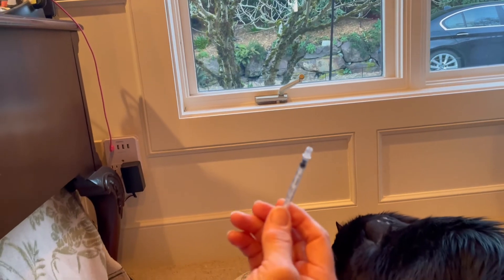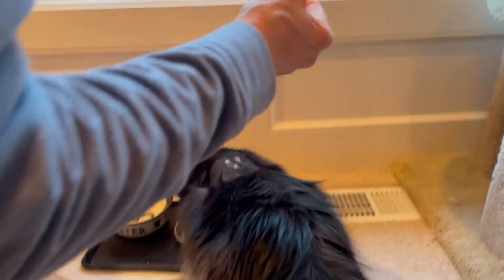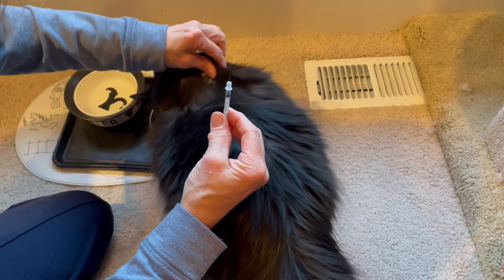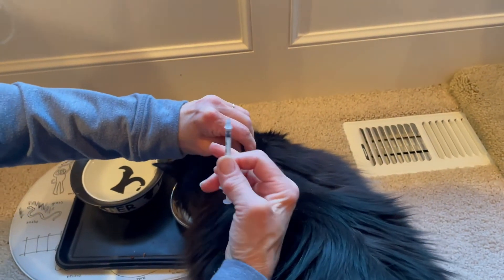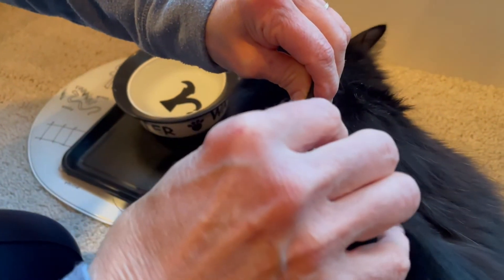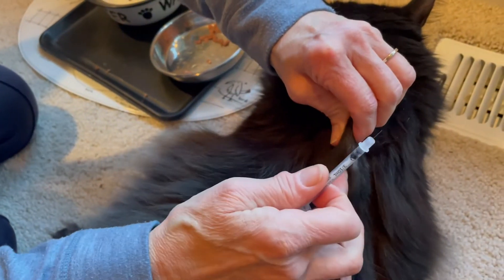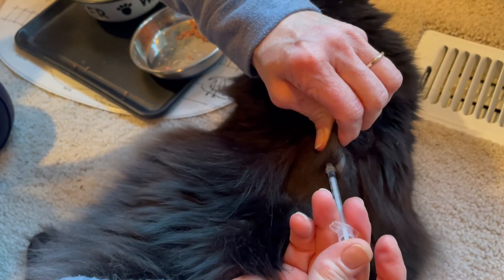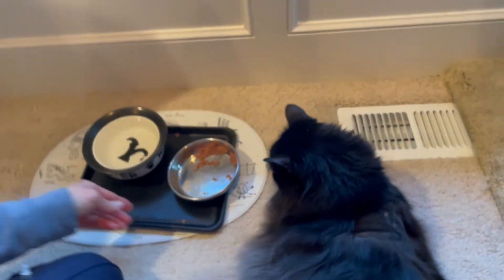It's a tiny little needle. Come over here, little Miss Tabitha. You grasp her skin — just want to pull up some skin. You can see this little pocket that it makes here. Right there, just go at a 45-degree angle. Hold still — poke down, inject, and she's done. And she says, I didn't even notice!